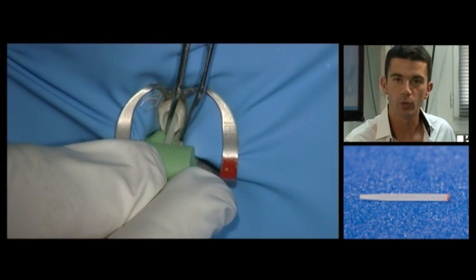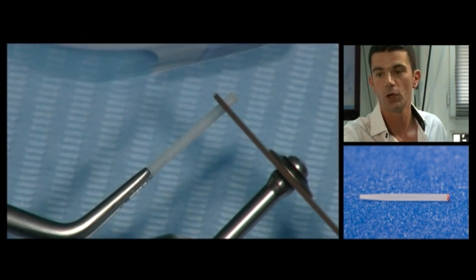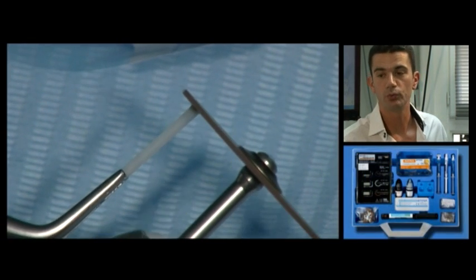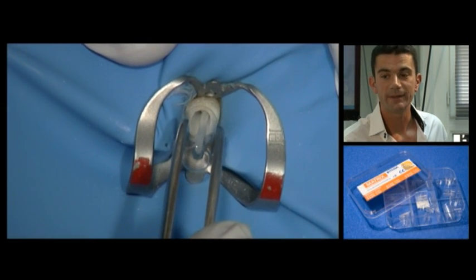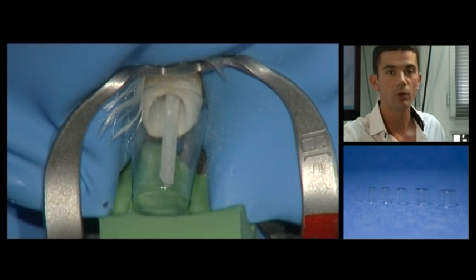A silicon key prepared earlier is used to check the relationship of the post to the future palatal face of the tooth to be restored. Once the post has been adjusted, it is sectioned with a speedy disc or a cutting plier. The post is then tried out on its own or with a matrix.